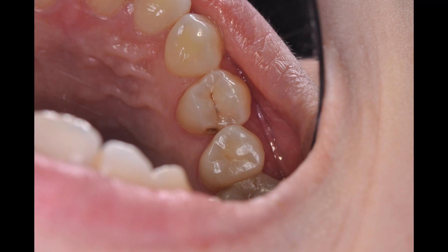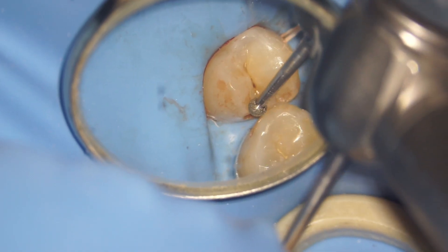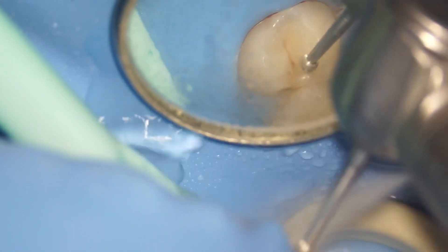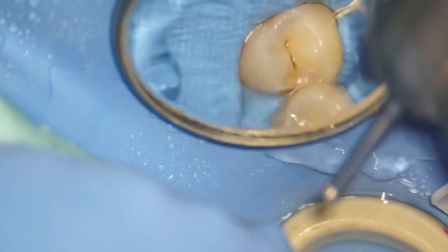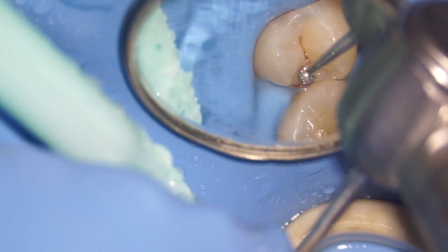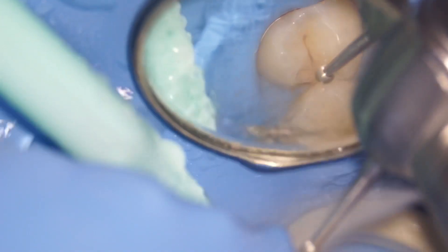To give a small brief history, this is a patient that came in with throbbing pain in relation to the 1,4. From the looks of it, it looked like a very small enamel caries — you can see on the distal surface of the 1,4. But this tooth had tenderness on percussion, so I was expecting a deep caries, though from the look of it, it might not be very deep.